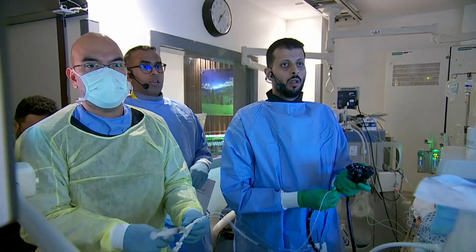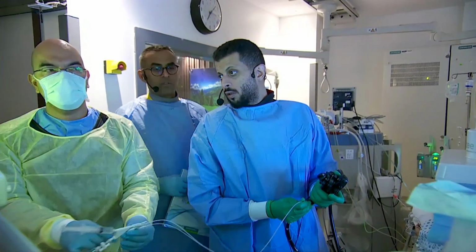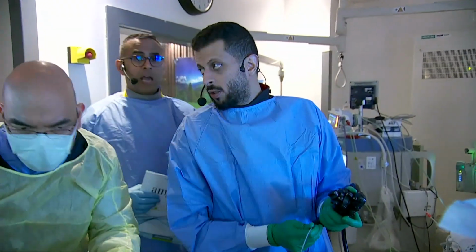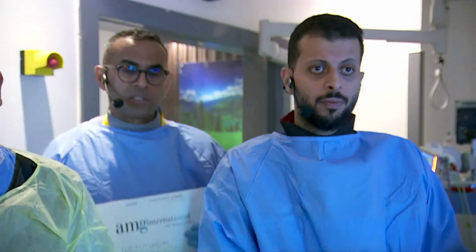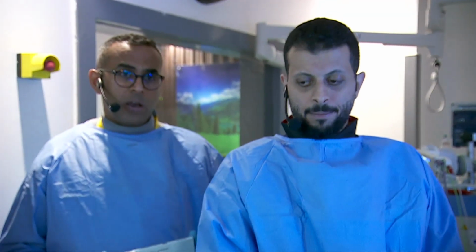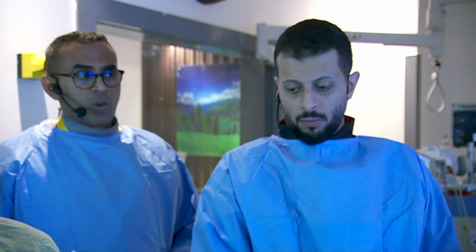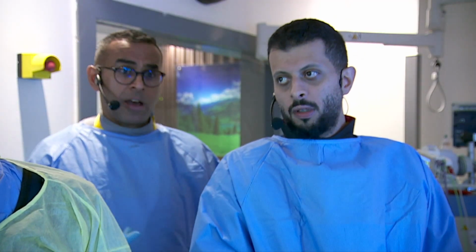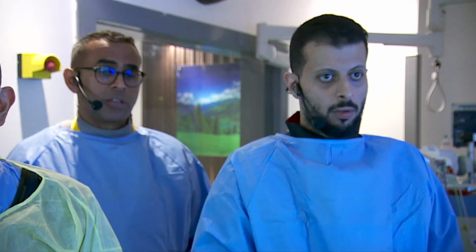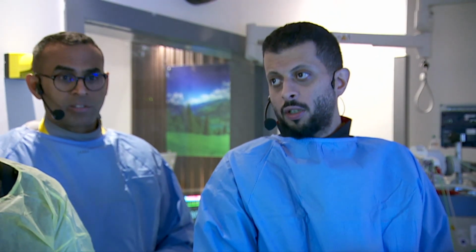Yeah, I mean, you can definitely consider them for that. I myself would try them in case you had difficult cannulation and ended up putting in a pancreatic stent. I would rather put the Archimedes, the fast dissolving one, which can just disappear in 10 days. Otherwise we have to bring those patients back to make sure the pancreatic stent has fallen off, or it can lead to pancreatitis. So this is another solution to minimize the need to repeat the procedure, in case you have difficulties with slots and time.